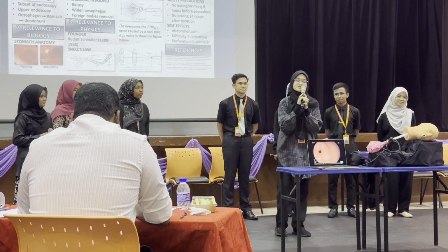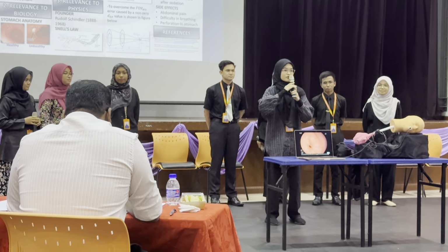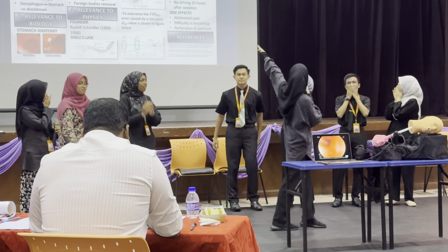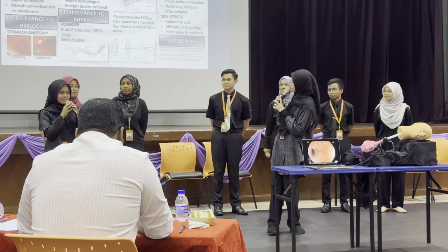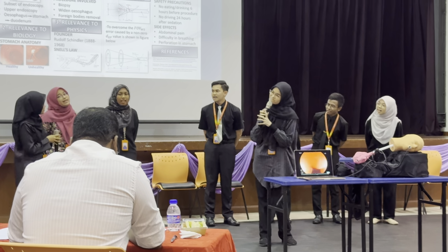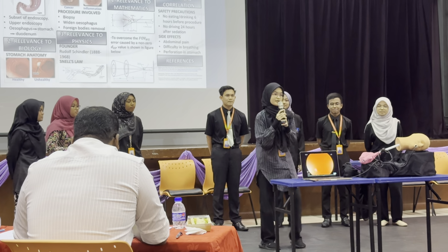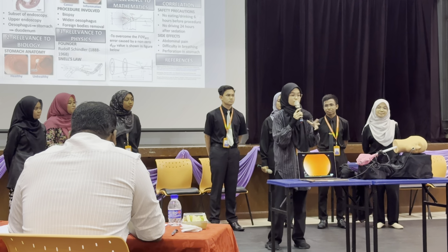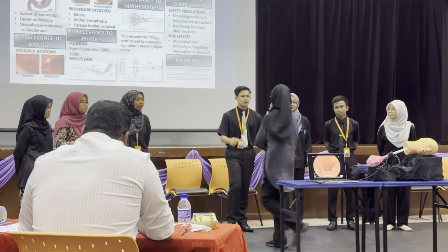Okay, basically, gastroscopy can be used to detect ulcers, inflammation, and also cancer. Here is how it looks. I read that sometimes we need additional procedures. Is that right? Well, that's definitely true. Sometimes gastroscopy is combined with biopsies for further diagnosis. Other than that, it is used for the widening of the esophagus and the removal of foreign bodies.